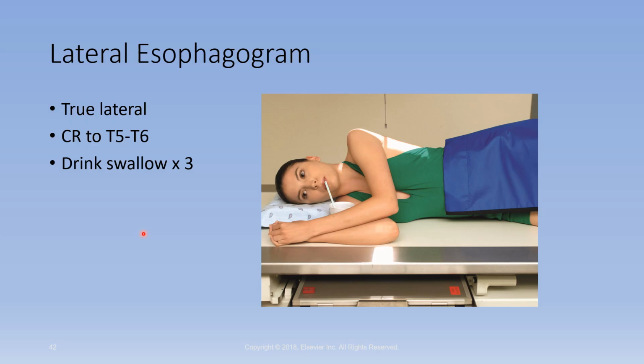Okay, 110 kVp at 2 mAs for a single contrast study. If you're doing a double contrast study or using the water-soluble contrast, you would be 90 at 2. That's for the RAO.